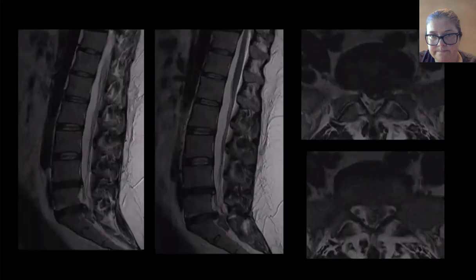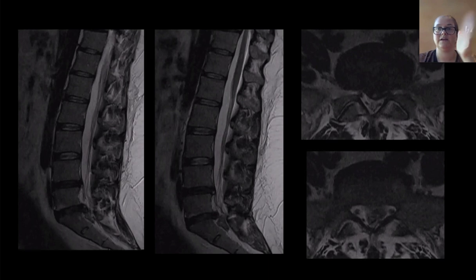So when you say subarticular, that's for the location. A disc can be central, subarticular, foraminal, or extraforaminal. Okay, so subarticular meaning below what? Is it below the pedicle? It's medial to the pedicle. I think it's sub relative to the facet joint. I see, sub relative. I've never understood that.